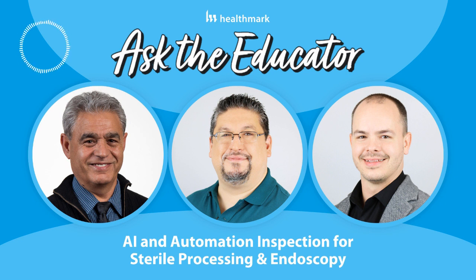Microscopes, borescopes, and the swing arm magnifiers, by the way, that most of us have on our workstations, are really only about 2 to 2.25 times magnification. That's great. It's better than our naked eye, but it's usually still not enough to catch a lot of the defects that we're seeing. Intuitive, in their IFU, specifies 4x magnification because they know 2x doesn't see close enough to actually see some of the damage that can happen with some of these items.